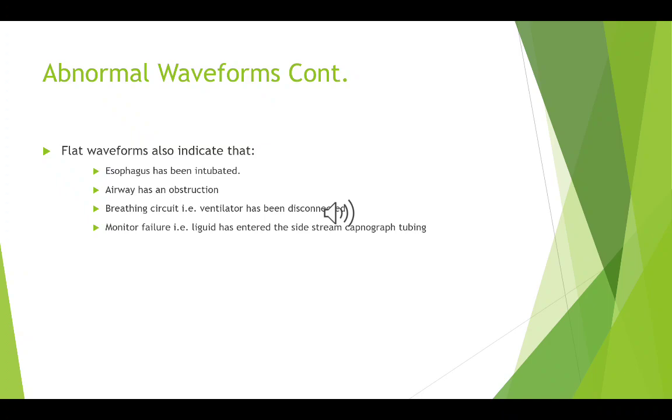Also going back to waveform capnography being a standard of care, it honestly seems like it really can save your butt and the patient, if anything goes wrong, such as if your breathing circuit, i.e. your vent, has been disconnected, if you have a blockage in your airway, if the esophagus has been intubated, or if you have monitor failure, your waveform would be a flat line.